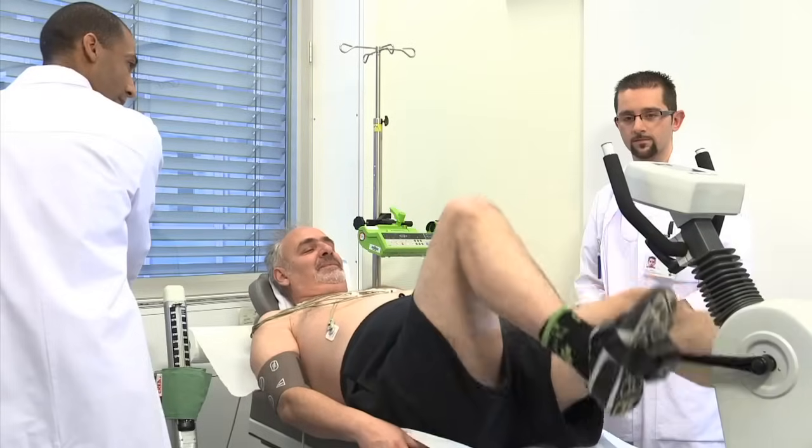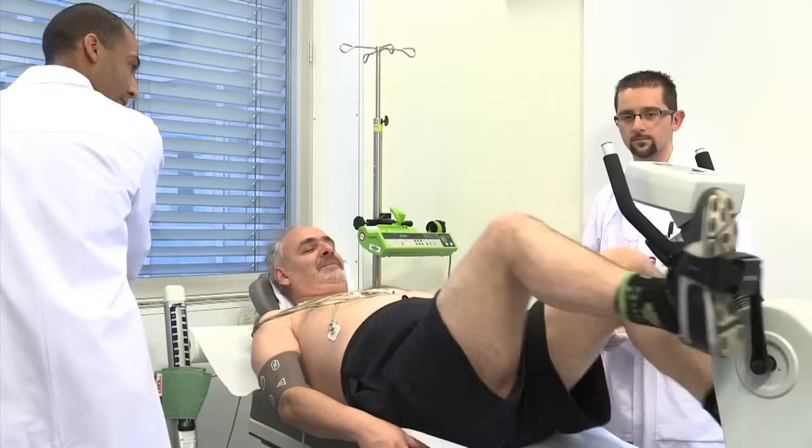Avant votre examen, vous recevrez des informations détaillées sur ses avantages et ses risques par l'équipe médicale. Bonjour madame. Bonjour monsieur. J'ai rendez-vous pour une scintigraphie cardiaque.